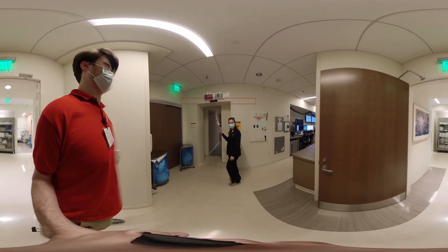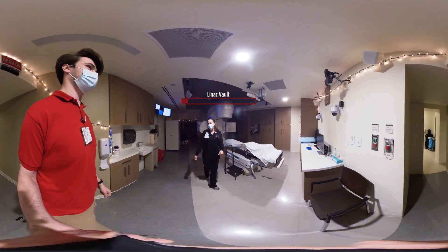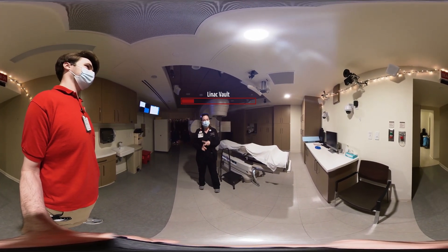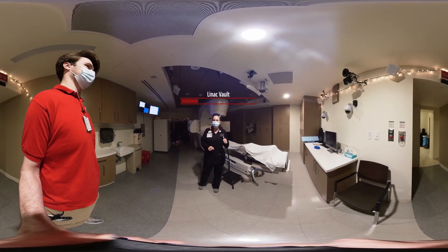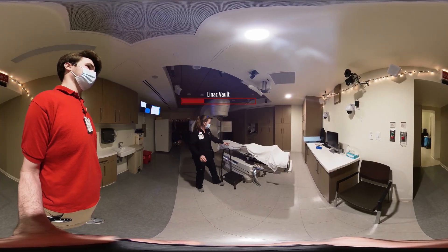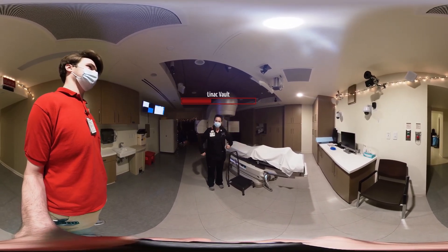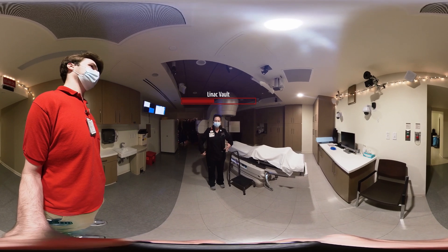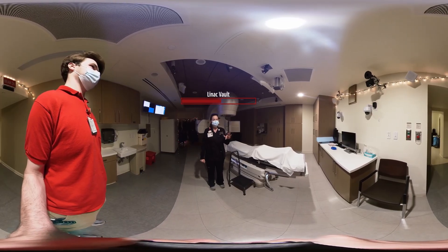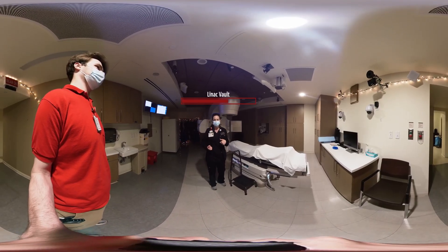My name is Sabrina. We're going to head on back into LA one — this is where you're going to be receiving your treatment every day. Every day that you come into this room, we are going to ask you for some pieces of information: your full name and your birthday, and just for today, we can confirm we're all on the same page. If you could tell me what area of your body we're going to be treating. In just a second, we're going to have you lay on the table. We're going to get you lined up to those marks that you got at CT. Once we get those lined up, we're going to make adjustments based on what the planning team gave us, then step outside the room and take a few images to verify that everything's lined up the way it's supposed to.